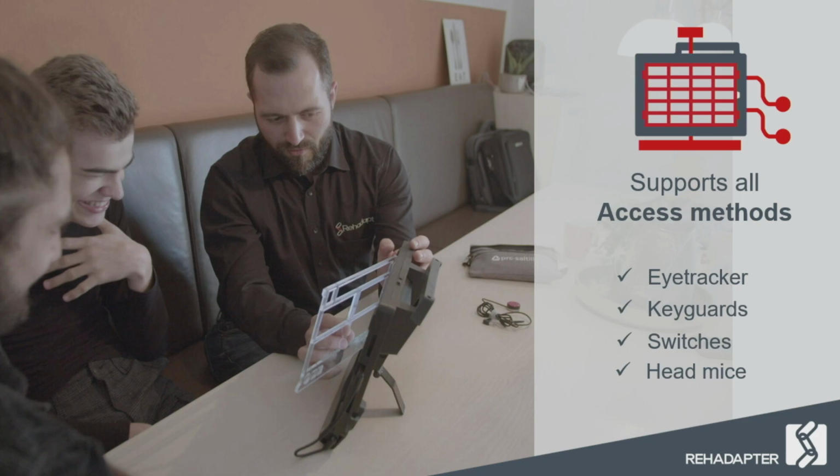When it comes to the keyguards, we started in the beginning with several keyguard versions for the iPad 10.2 for several apps, and one thing that we are really proud of is to provide an individual keyguard service. So who of you has customers that have specific requirements when it comes to the field structure of these keyguards? Often you say, well, okay, I only need a standard layout, but sometimes a customer requires, oh, I only need really small and round fields, or I need them bigger, or I don't want all of these fields to be accessible, or I need to have space in between these fields.